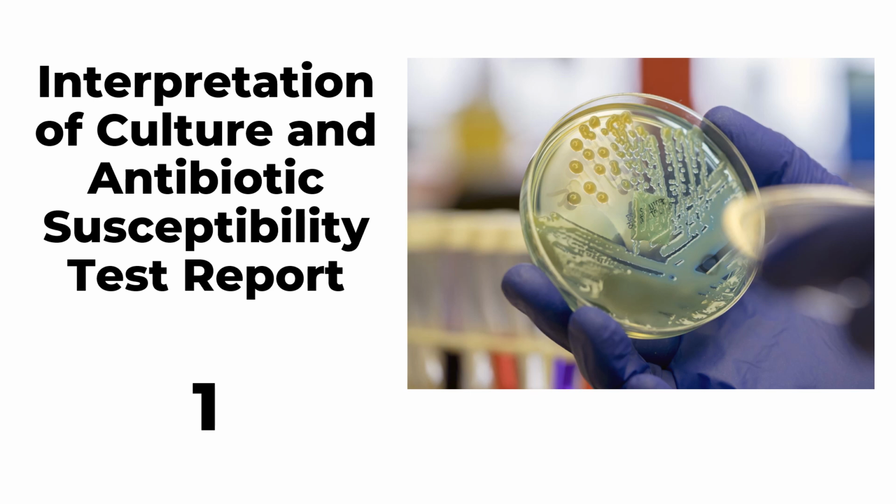Microbiology reports are very different from the pathology and the radiology reports in the way they are multi-part results. Each of the microbiology reports further has sub-parameters like microscopy, culture identification, and culture sensitivity. Let us understand how to interpret these sub-parameters.